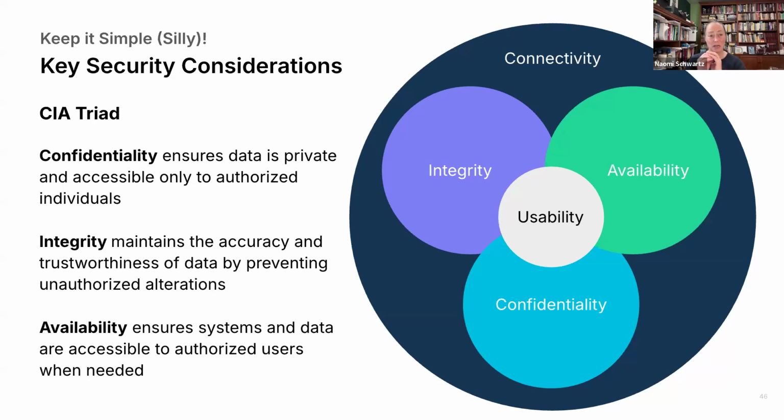But at the core of those three is usability. And usability has a lot of friction with cybersecurity. So you really need to account for who is the user, what is their maturity level in managing all of this? How do I take as much burden off of them as possible and keep my device simple so that my 90-year-old grandmother isn't trying to figure out what these words mean, whereas my 12-year-old son would be like, oh, grandma, it just means X, Y, and Z. Like, we need to keep it at a level that every potential user can understand and work through. And that is really, really hard.